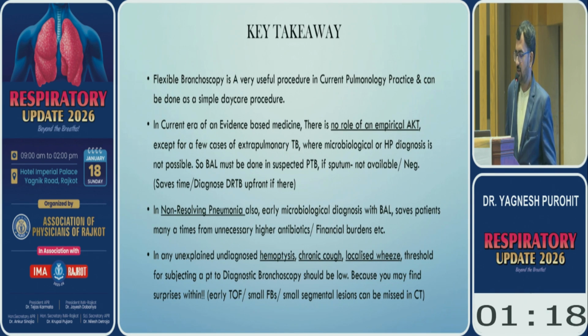Summarizing the key takeaways: flexible bronchoscopy is a very useful procedure in current practice, and it can be done as a simple daycare procedure. In the current era of evidence-based medicine, there is no role of empirical AKT, except in a few cases of extrapulmonary TB, where we cannot sample it. In non-resolving pneumonia also, if we do an early microbiological diagnosis, then we can save the patient from unnecessary higher antibiotics and unnecessary financial burdens.